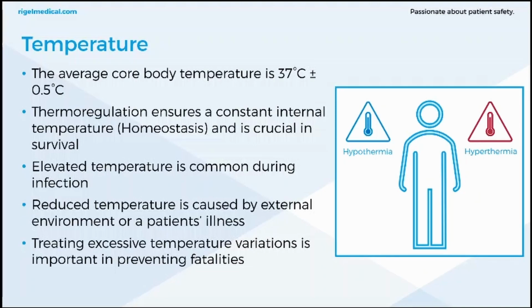Now these are not just in healthcare environments. You've seen these at all types of events, sports centres. They use them all over the country, all over the world, as a form of quick measurement of your internal body temperature. And the average core body temperature is 37 degrees plus or minus 0.5, and this can vary by gender and between different stages of the day. Now I've tested this myself. If I've got up very early in the morning, my temperature is really low, it's below 36, and it starts to rise throughout the day.